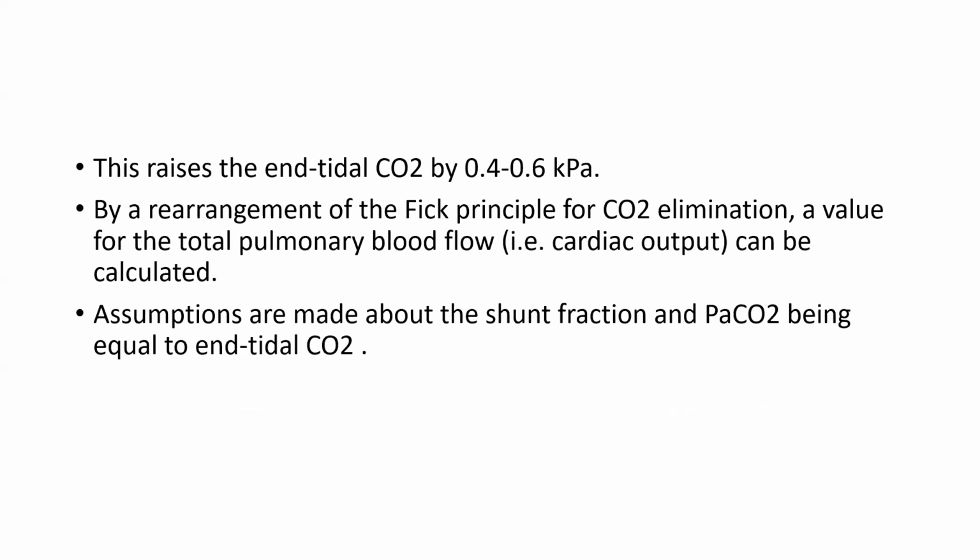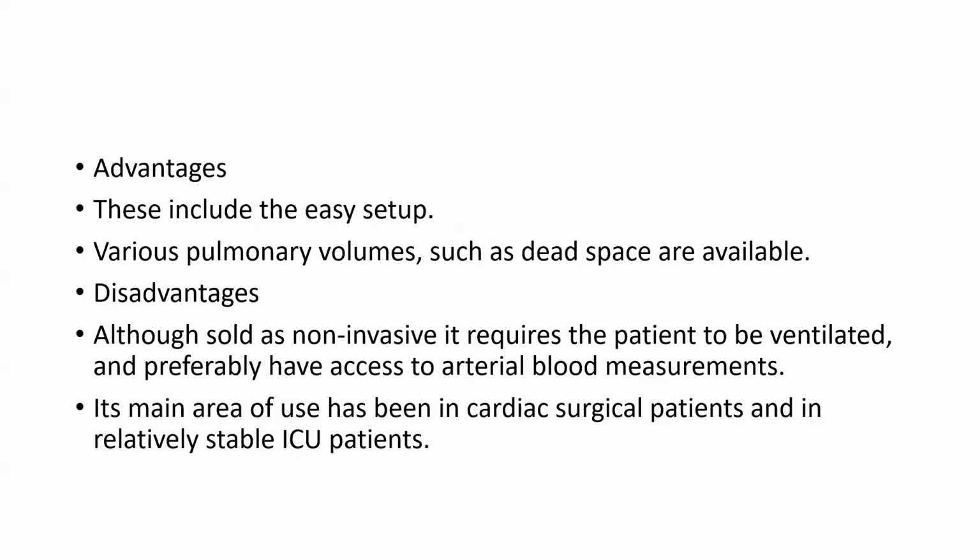This raises the end tidal CO2 by 0.4 to 0.6 kilopascals. By rearrangement of the Fick principle for CO2 elimination, a value for the total pulmonary artery blood flow can be calculated. Assumptions are made about the shunt fraction and peak PaCO2 being equal to end tidal CO2.